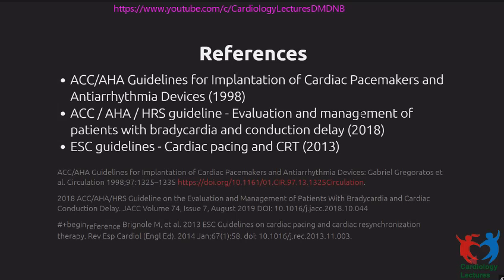PPI-induced LV dysfunction, how to prevent this? Like I said, the main high-risk group is patients with reduced ejection fraction at baseline. So if anybody with heart block, you're going to put in a pacemaker, and already their EF is 45, always consider a CRT directly. When I say CRT, I think in the current era, automatically consider His bundle or left bundle pacing as synonyms. So consider that instead of simply putting in a VVI or DDD pacemaker. That is the best mode of prevention.